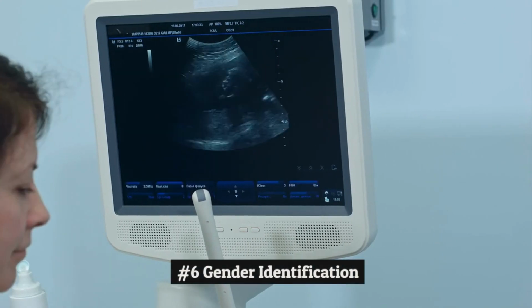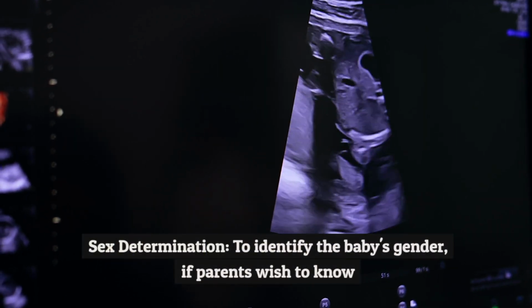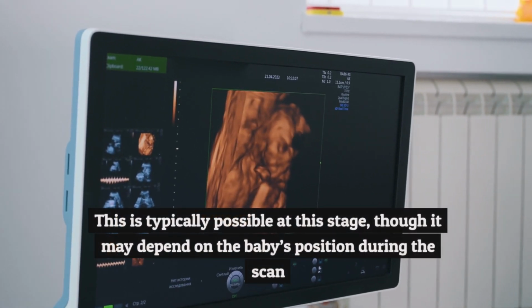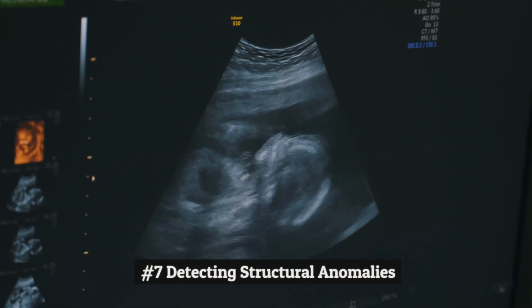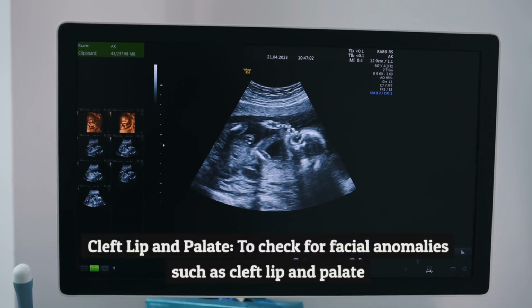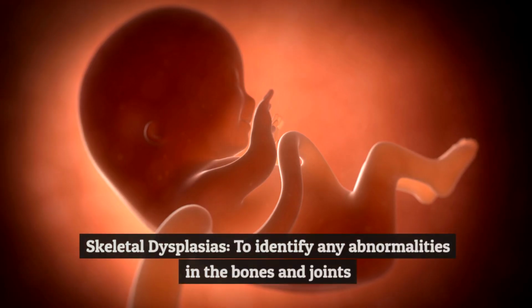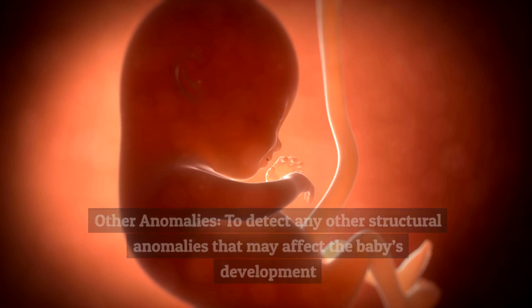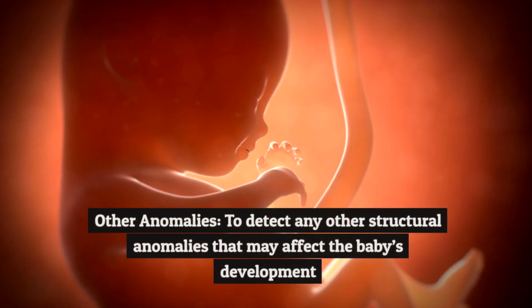Number 6, gender identification. Sex determination, to identify the baby's gender if parents wish to know. This is typically possible at this stage, though it may depend on the baby's position during the scan. Number 7, detecting structural anomalies. Cleft lip and palate, to check for facial anomalies such as cleft lip and palate. Skeletal dysplasias, to identify any abnormalities in the bones and joints. Other anomalies, to detect any other structural anomalies that may affect the baby's development.